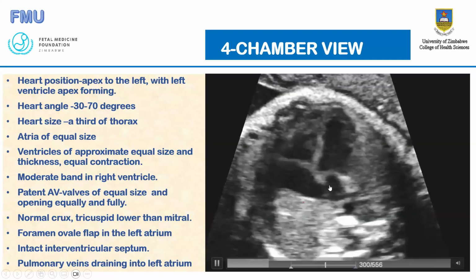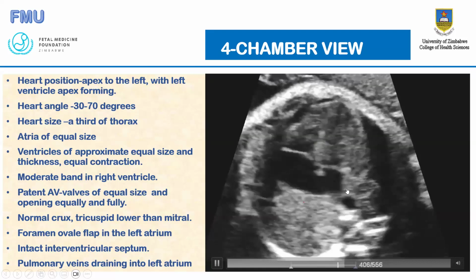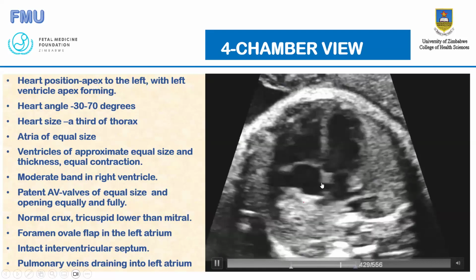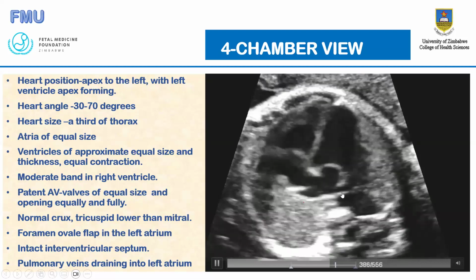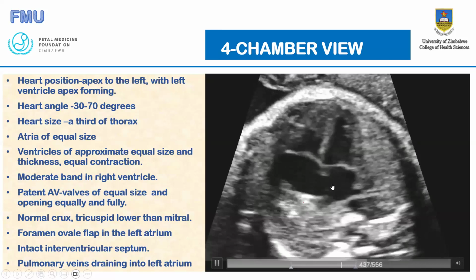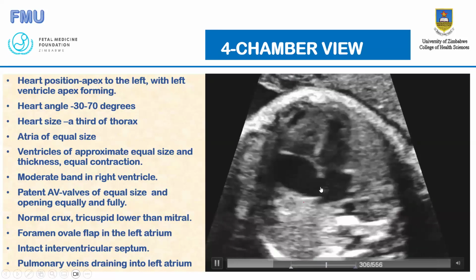In certain conditions, the flap is pushed over. These are very gross fetal defects. So if you see it on the right, then you know we are in trouble. There is something going on in the heart which is a little bit serious, that pushes the pressures and makes the valve deflate and go in the opposite direction.